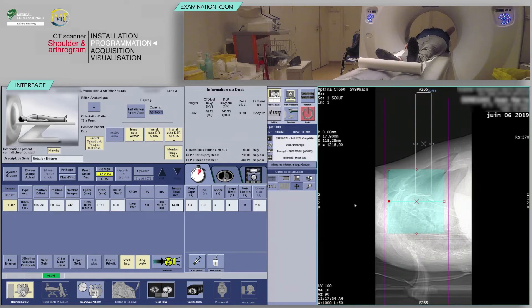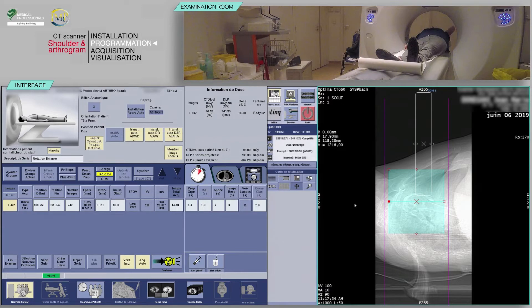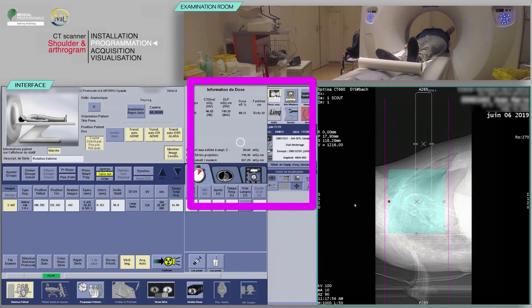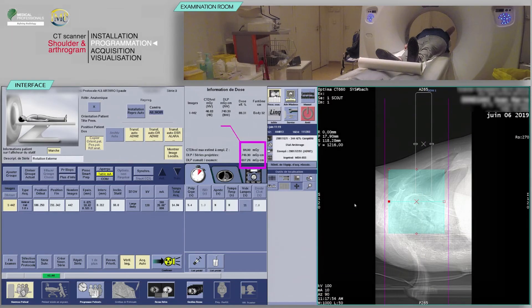Check the consistency of the acquisition parameters, which are often pre-configured. Before continuing, check that the predicted dose is consistent with the diagnostic guideline values.